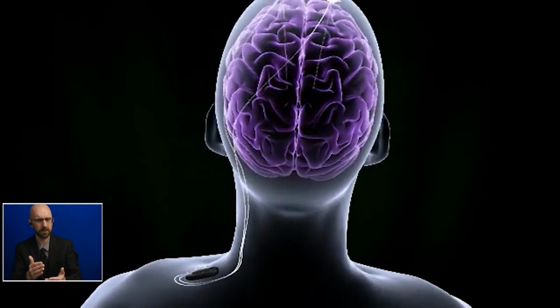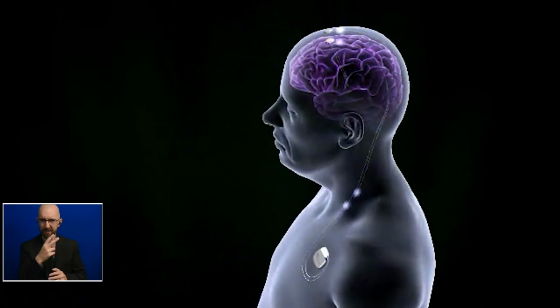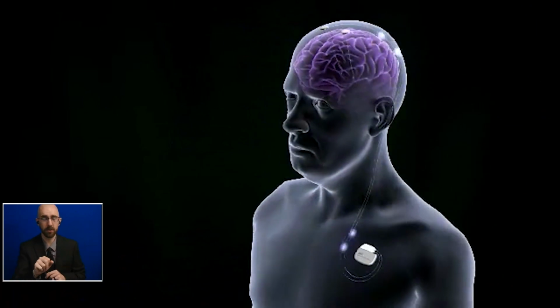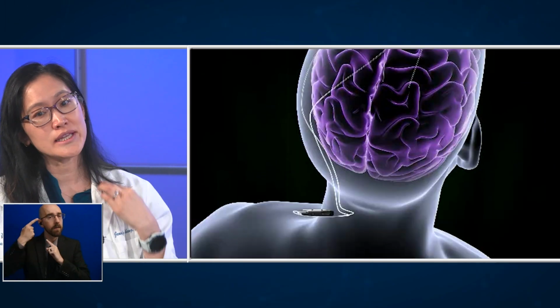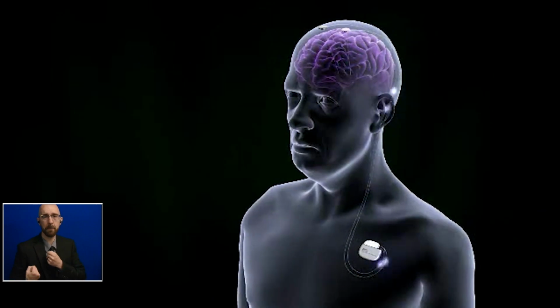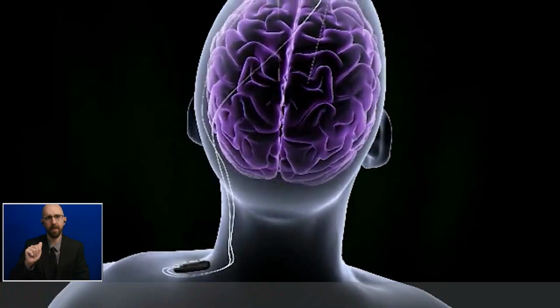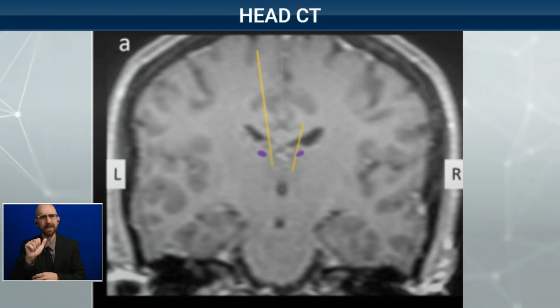So Dr. Chang, explain then how the DBS works. So for the deep brain stimulator system, there are 2 wires that are implanted into the brain, into a target within the thalamus. So there's one for the right brain and one for the left brain. And then those wires are connected to extension wires brought under the skin and connected to a battery, which is implanted under the skin of the chest. So as you can see in the little schematic, that electrical stimulation travels to the brain target in the thalamus to treat epilepsy. And you shared a brain scan with a couple of lines and spots. What are we seeing here?